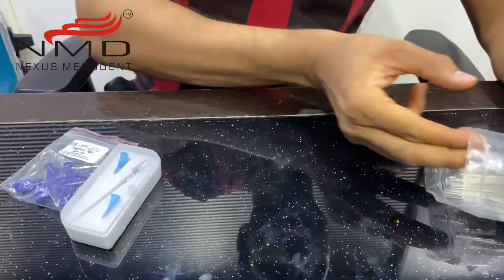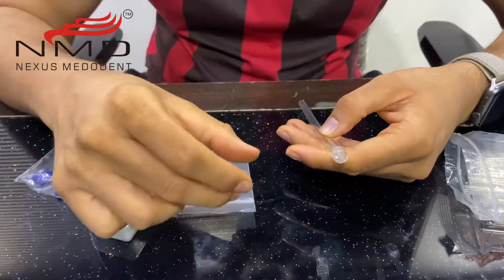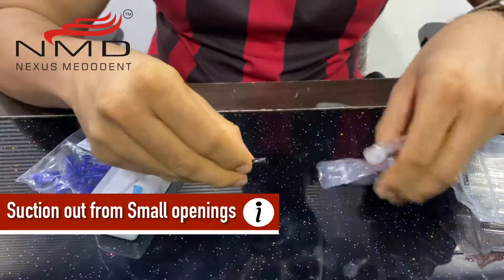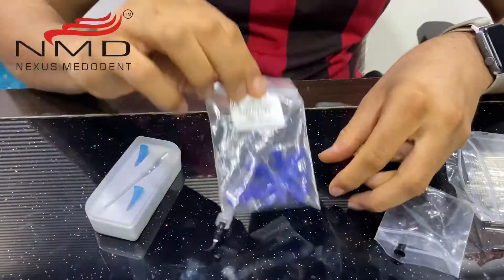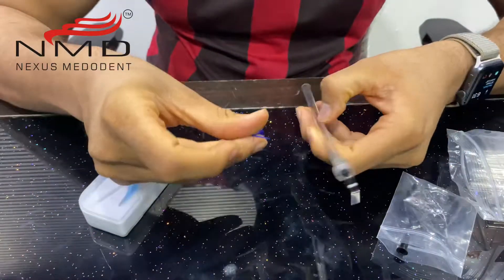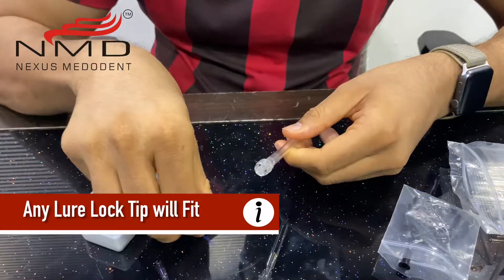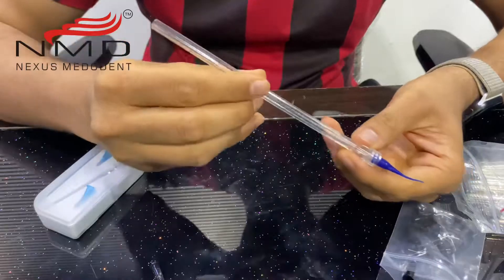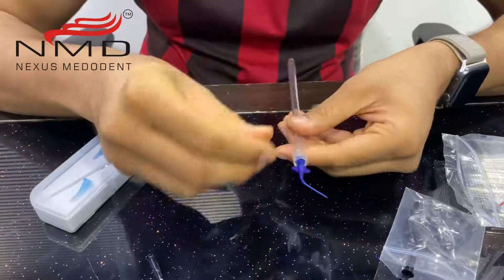So if you want to suction out any leftover liquid from the root canal wherein the opening is very narrow, this is going to help you do that. Any luer lock pre-bend tip gets easily attached with this. We also have capillary tips, which are very thin and longer in length, and they are also easily compatible with these aspirator tips. So what this is going to do is suction out all the leftover liquid from the root canal.